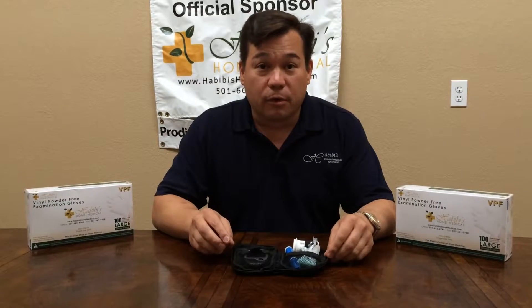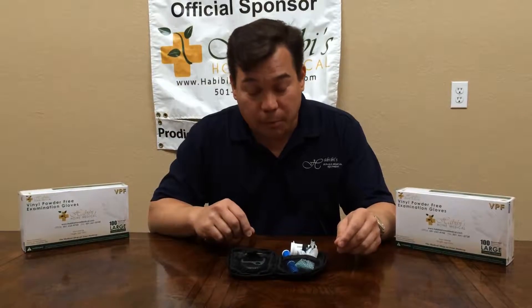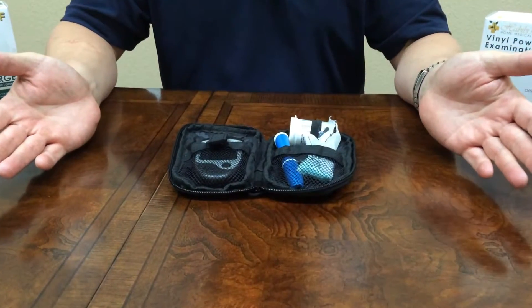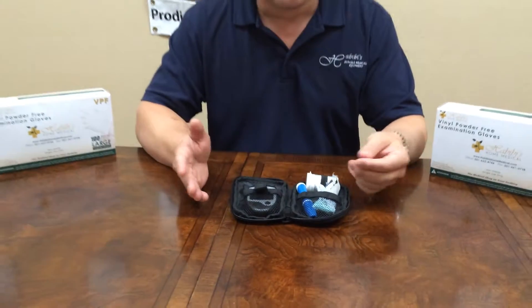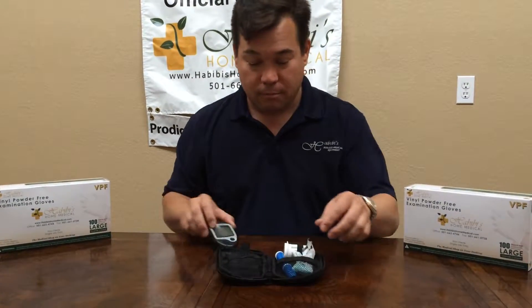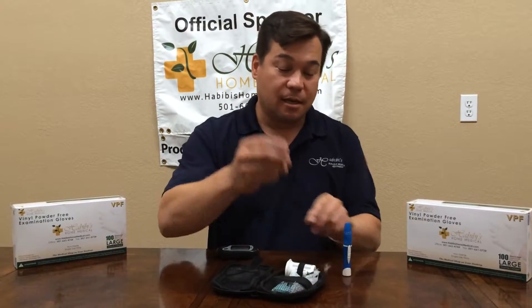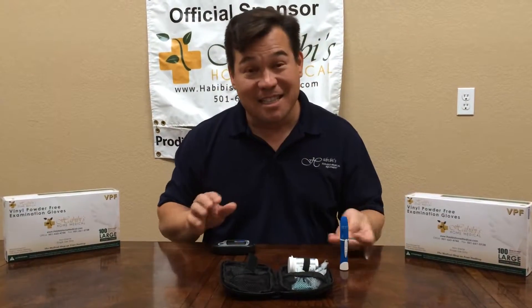If you need to know how to set up your Prodigy Talking Auto Code Meter, please refer to our previous video that shows how to set the meter up. Now as you can see, we've got the meter and all the equipment and supplies laid out very orderly. I have them bring everything out — the meter, the lancet injector, a lancet, and one strip. I generally have them set the strip on top of the meter as it's easy to find again.